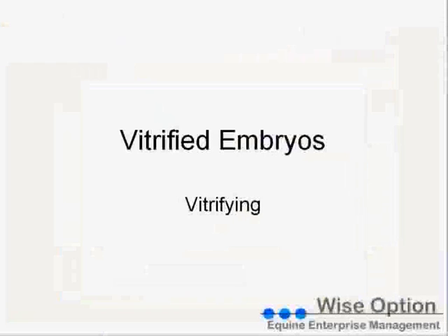So today, in this e-learning, we learned how to start vitrifying an embryo in WiseOption, using the vitrified module available from version 3.3.10 on.